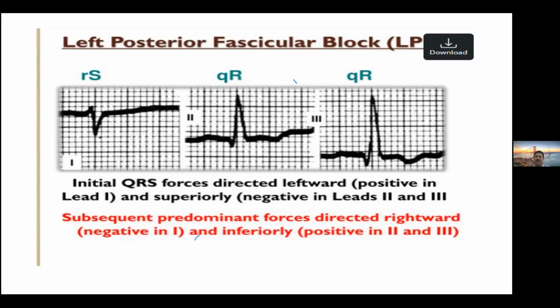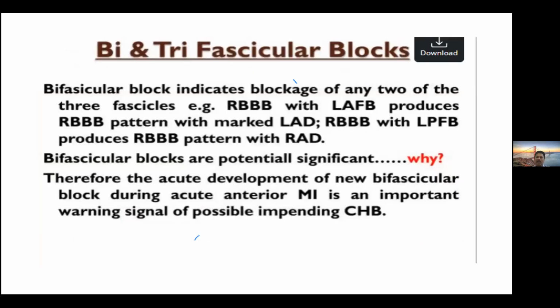It is diagnosed by exclusion because the left posterior fascicle is thicker, deeper, less affected by ischemia, less affected by degenerative changes. And it's not very common, so it is not a common diagnosis. Forget about it. So moving on to the next conduction block, bifascicular or trifascicular.